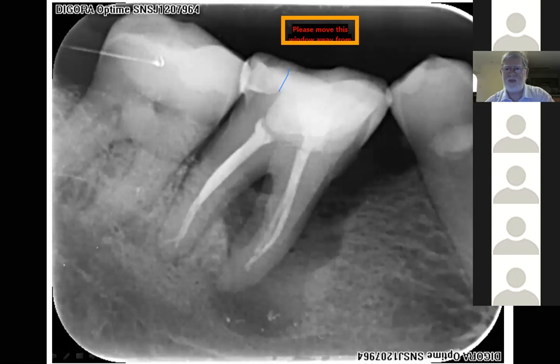And the reason why I'm asking for prognosis is because many a time I'm coming across with the students that they've seen this a few visits ago, they've referred the patient to postgrad perio. What can they do for this patient? I'll say no more. Prognosis is poor.